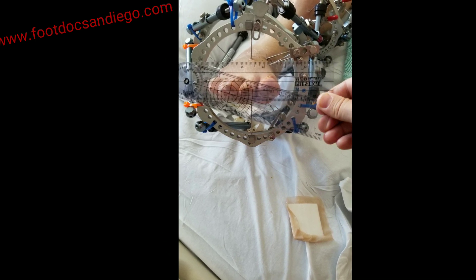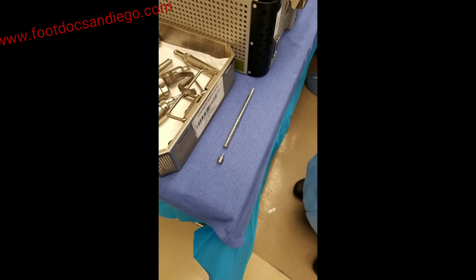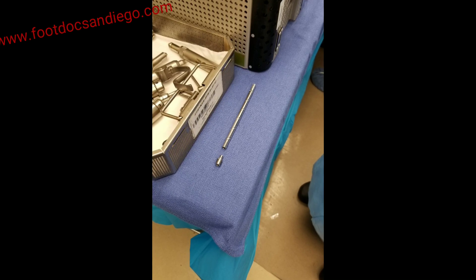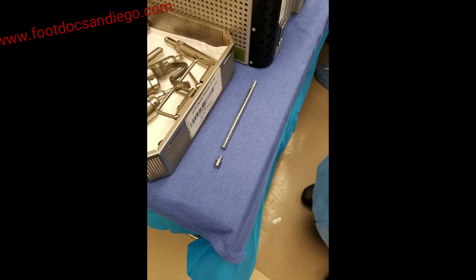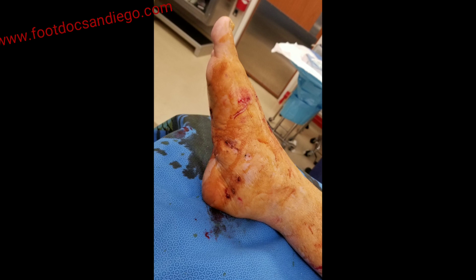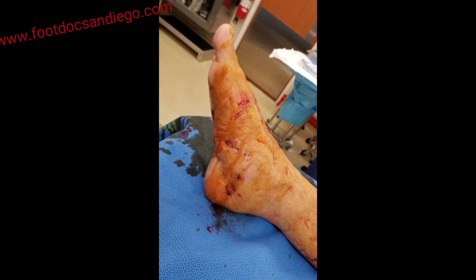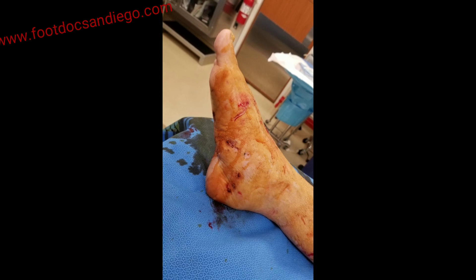This is all done via fluoroscopy and using goniometers. Once the correction is fully obtained, it is maintained with beaming of the medial and lateral columns. Here you can see the Orthofix G-beam system, which is very important for maintaining the correction. The G-beam is built to maintain loads on the medial column once inserted. Once the frame is removed and the correction is fully obtained, the foot is prepped and re-draped on the day of removal for insertion of the G-beam.